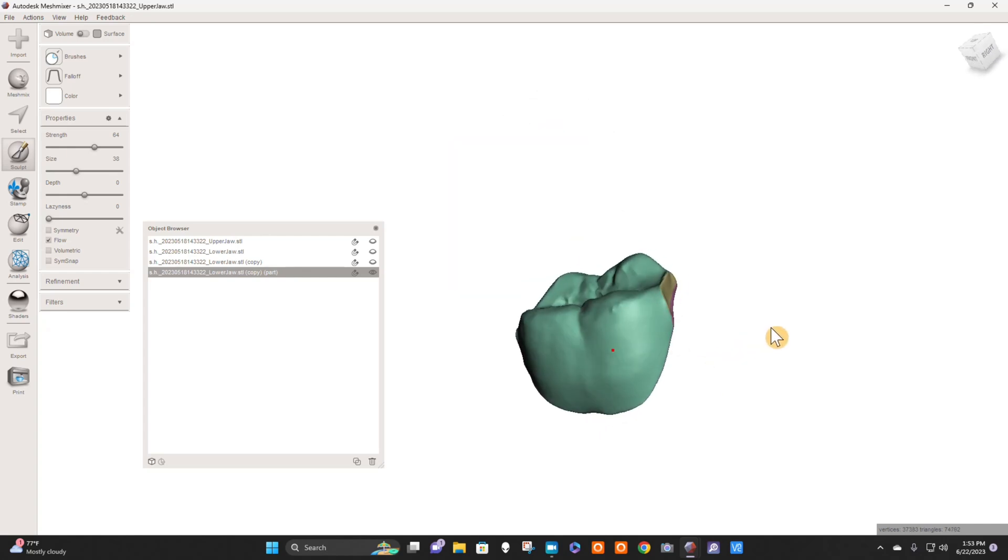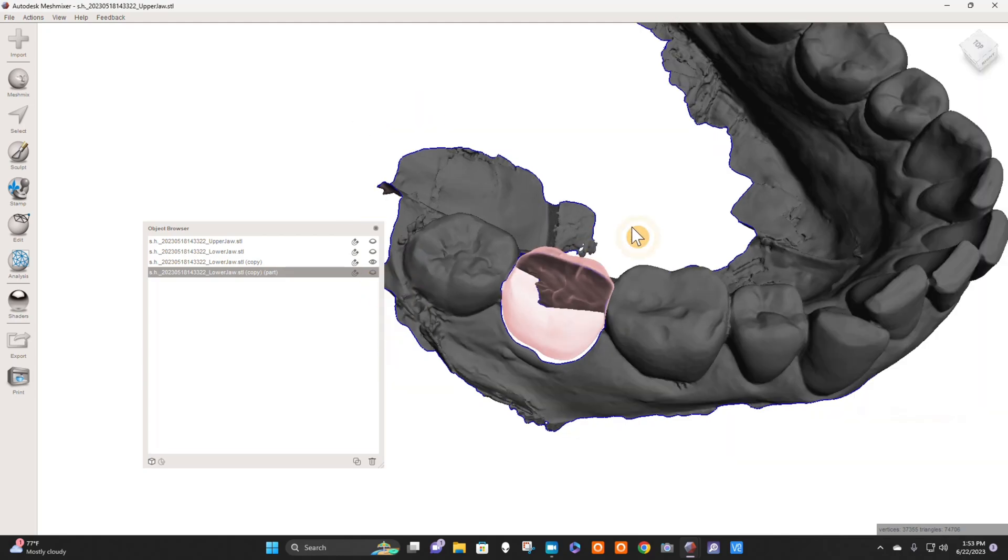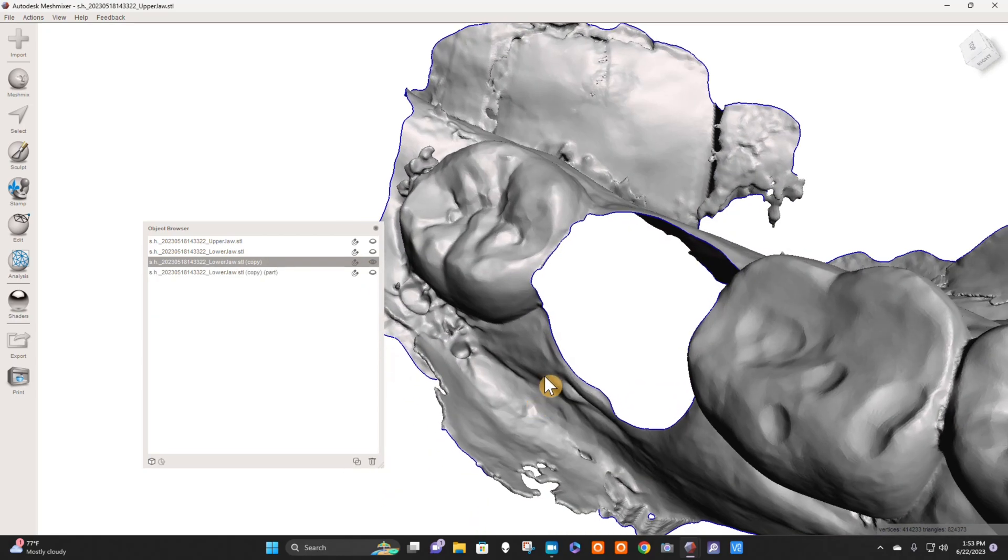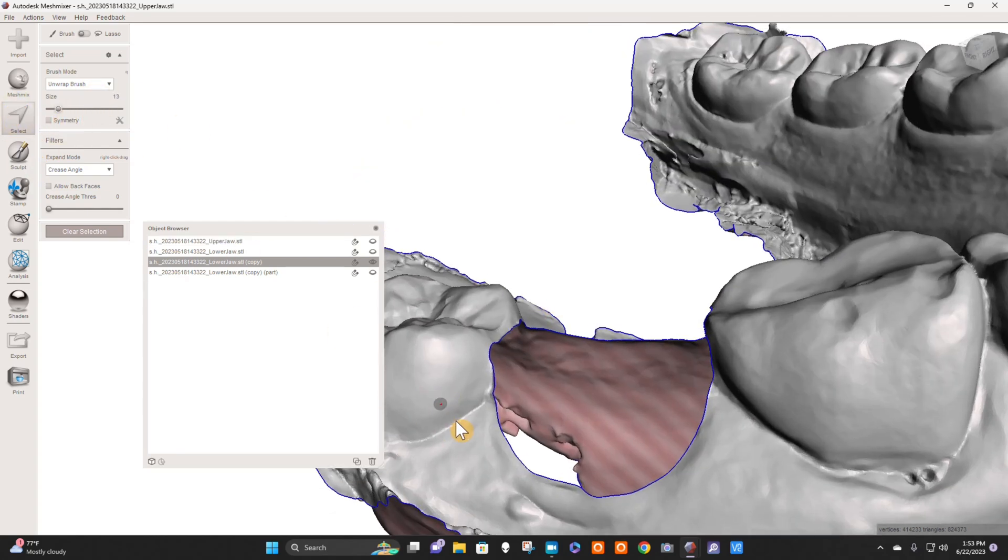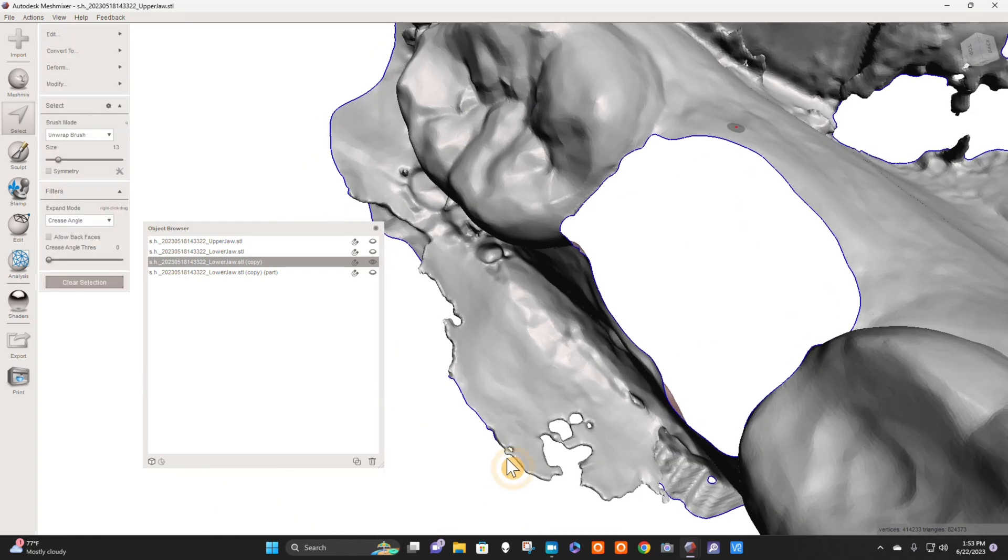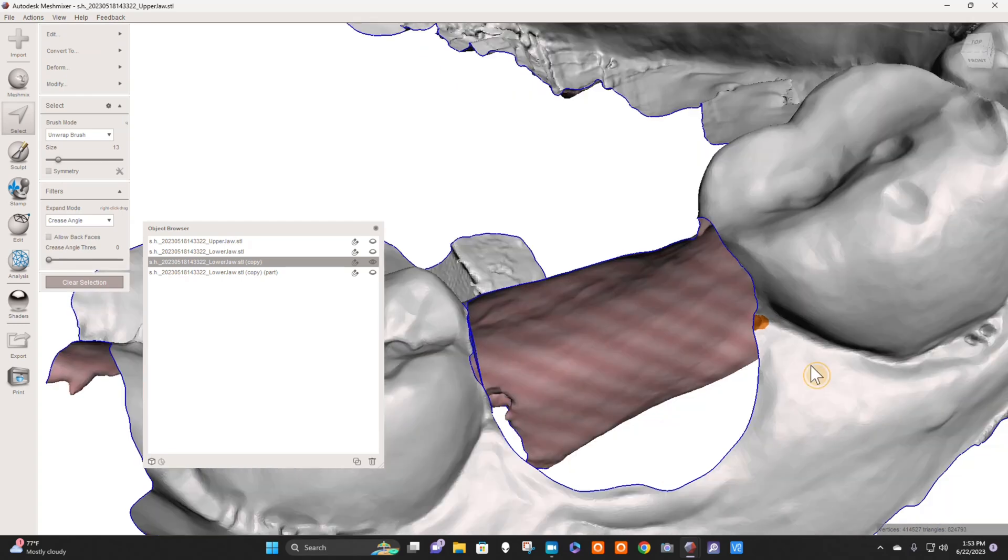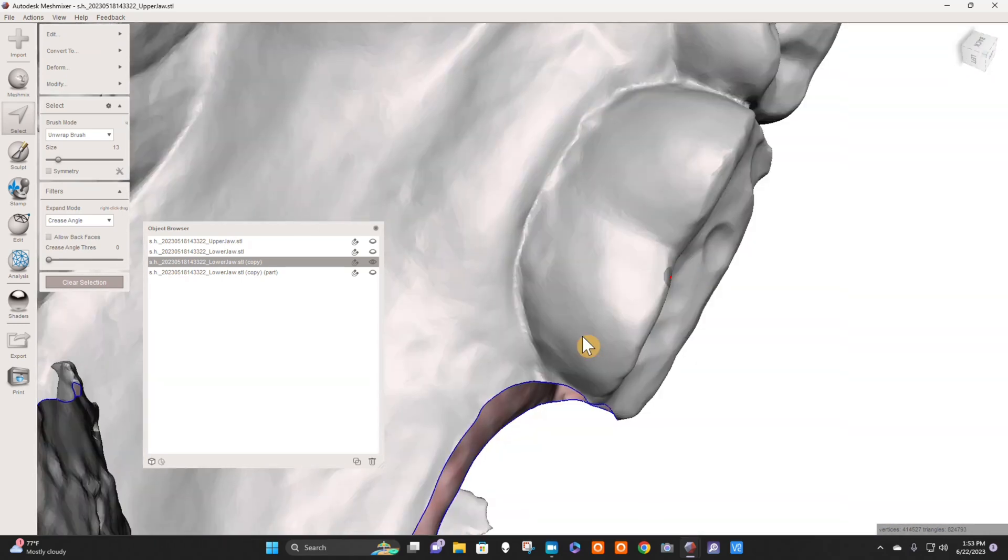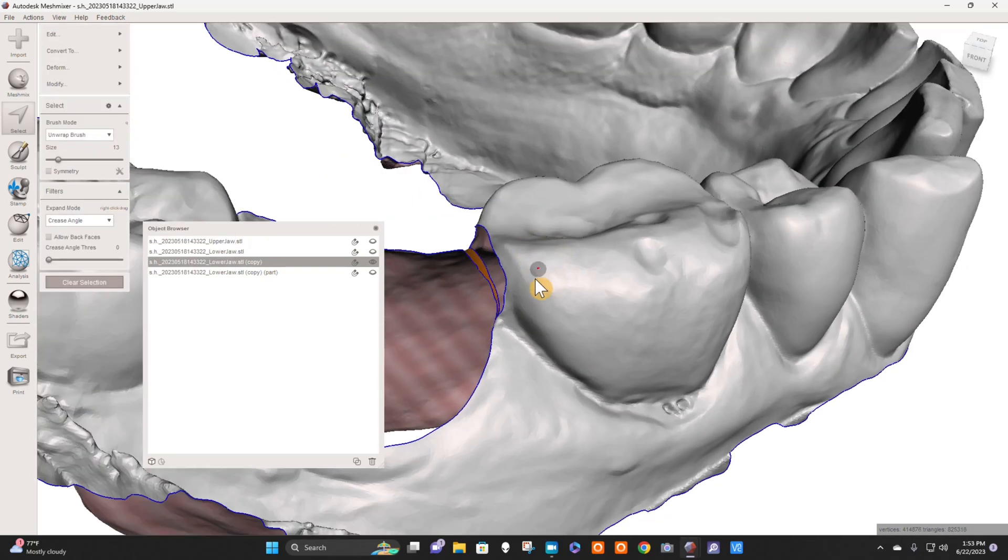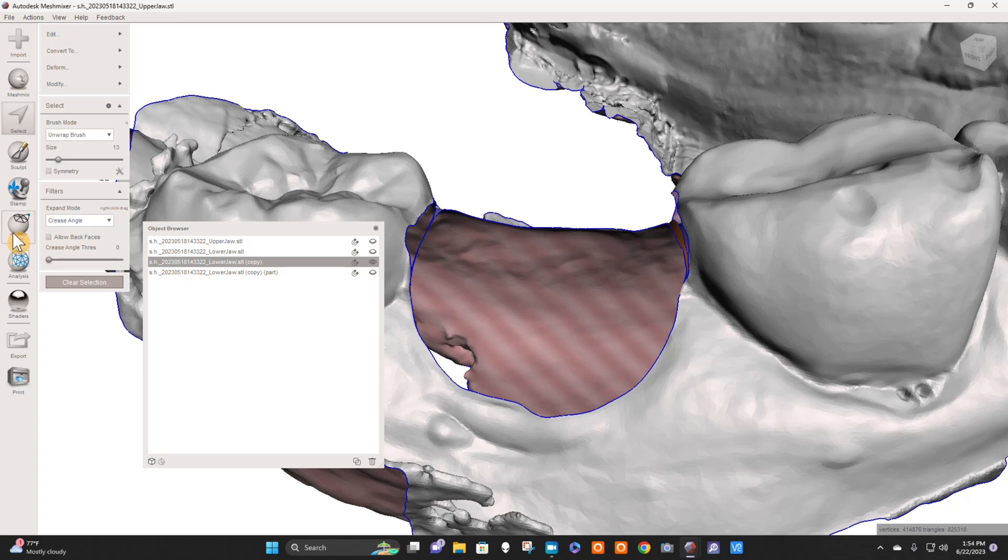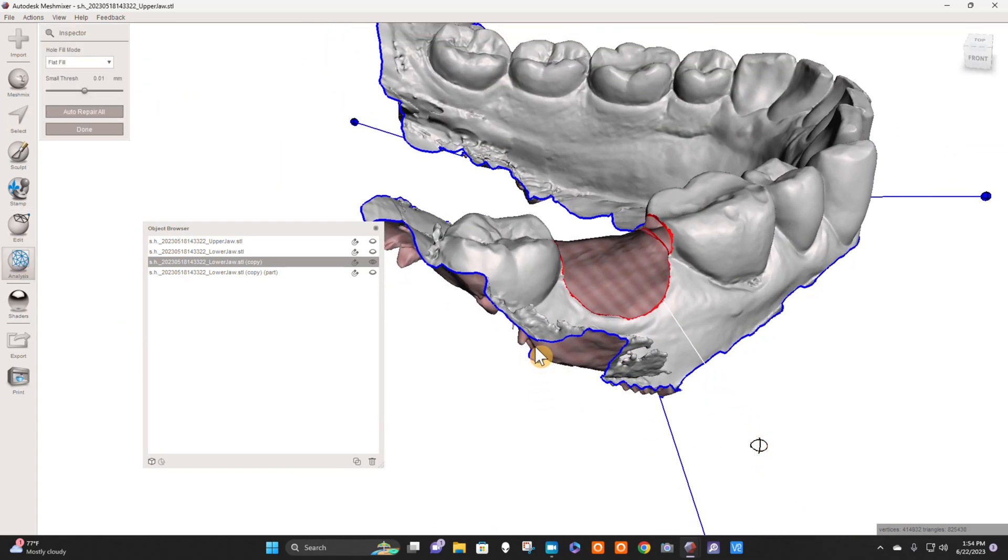Now we need to address the model, and you can do the same thing. I think it's worth it if you come in here and put your brush size down and select a little bit right here at the CEJ, a little bit right here, and then go to Edit Bridge, Accept, Clear. Select a little bit right here and a little bit right here, Edit Bridge, Ctrl B, Accept. I like to go through here now and go to Analysis Inspector.